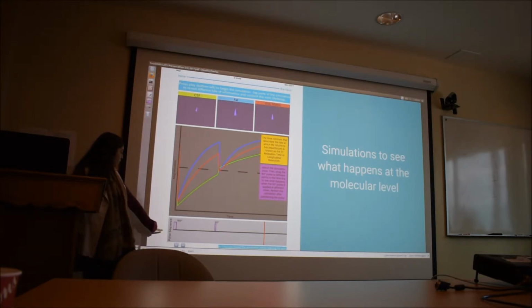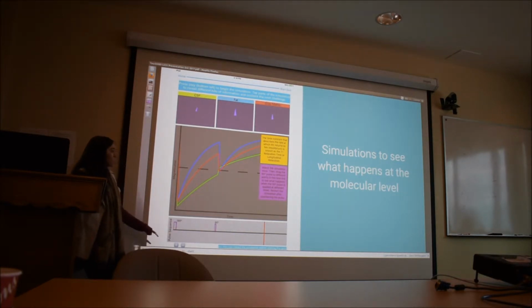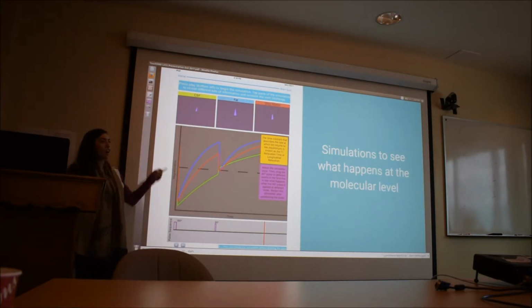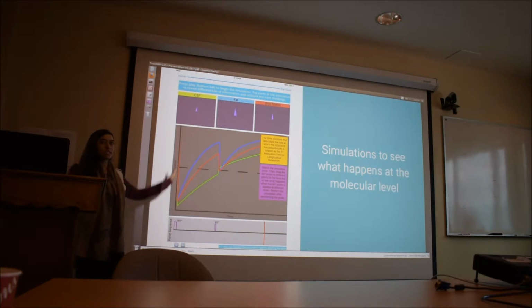As soon as the pulse ends, the vector starts to relax back into its original straight-up position, and that's when you see the magnetization vector going back up. As the cones are animating, you see the graph animating as well, so you can see how the changes exactly correspond to each other.